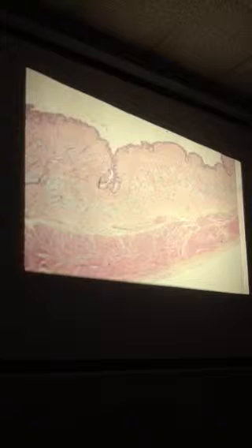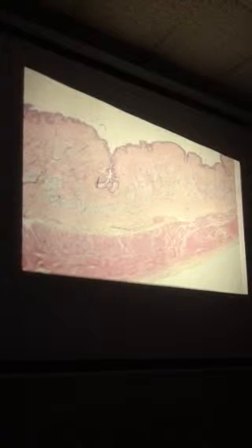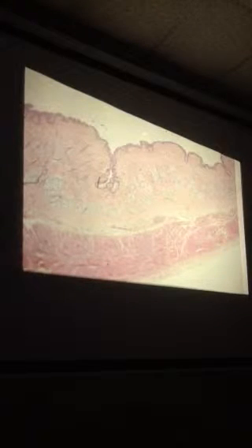Now we can go to the esophagus, where you first identify the 4 consistent layers of the GI tract wall. So it's just a matter of starting at the lumen, very thick from here all the way to where it lightens up. That's mucosa. The second layer, much lighter, usually lots of holes in it, which are blood vessels. Highly vascular layer, submucosa.